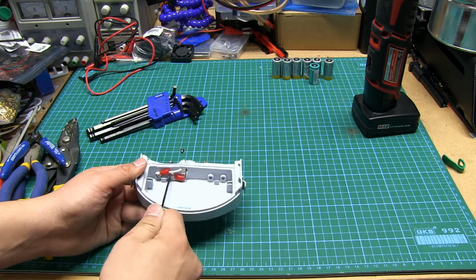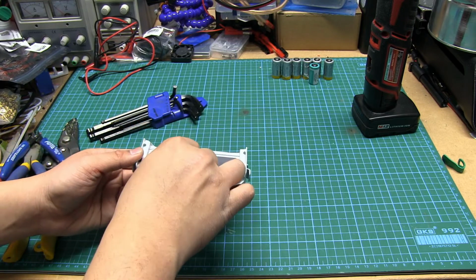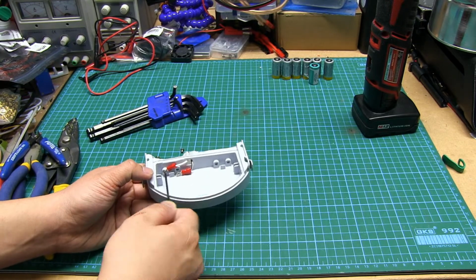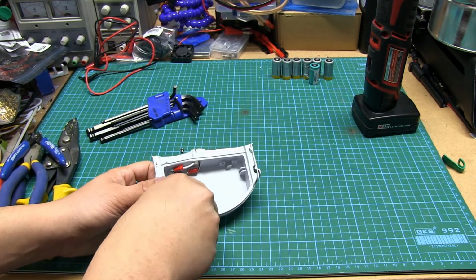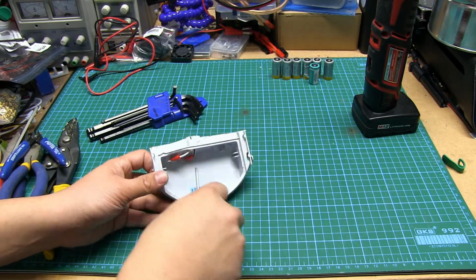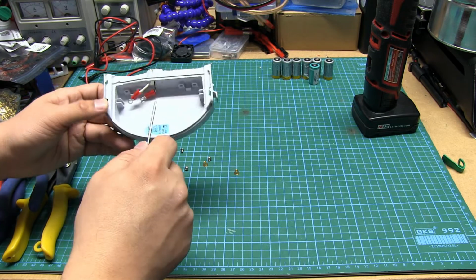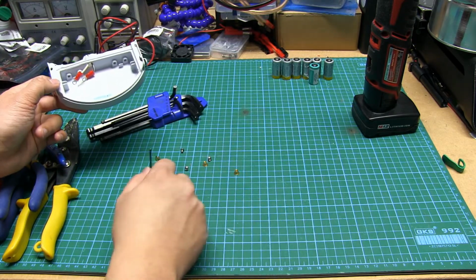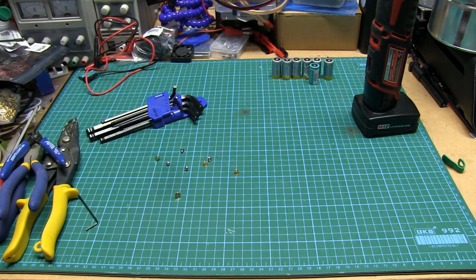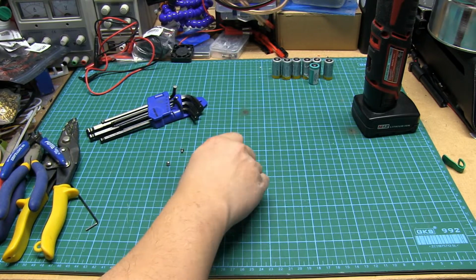These are interesting terminals, so I'm actually going to salvage and save these and just put them in a bin. You never know when you might need a useful gold terminal. But I think beyond that, I've taken it to bits and there's nothing spectacular here. I am finding that the super thin wires are actually fragmenting into lots of tiny little shards on this bench and getting stuck in my hands. So I'm going to call that garbage, that done, and I've taken this to bits. There's no more teardown because it's literally fully torn down.